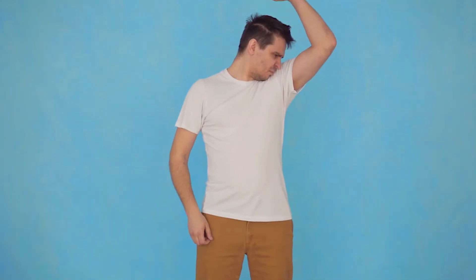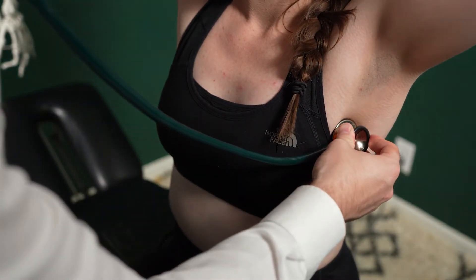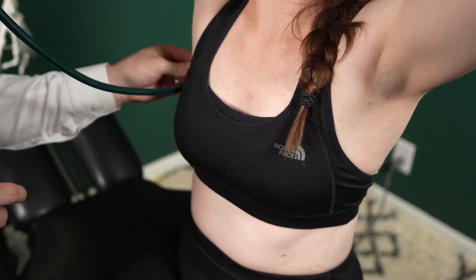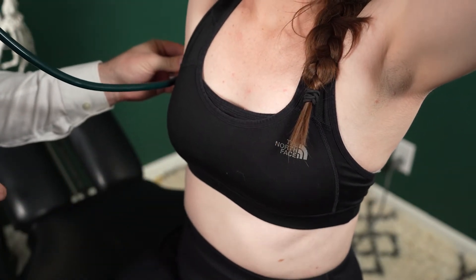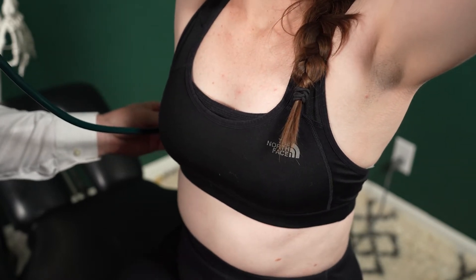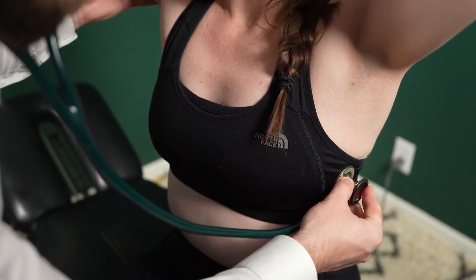The next part to check is the axillary space, which gives us the mid or lateral lung fields. Axilla just means armpit. Have the patient lift their arm and listen pretty much at the base of their armpit — have them take a deep breath in and out. Then go down another three to four inches and take another breath. Make sure your diaphragm is not on a rib bone, as it'll be really hard to hear — you want to be between two ribs.